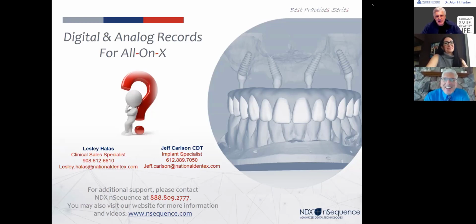As far as cone beam scanners go, I would very carefully look at the sharpness of the image, what they're showing you. There are a lot of machines out there now, and there's no really good resource to compare machines, as far as I know. So you really have to look at the image quality and the settings, because sometimes what they show you is at a different setting. Most machines you can range your settings. If you're doing a full arch case like this, you may have to increase your dosage. Again, the field of view: originally I had the original classic iCAT, and we could get a full image of the whole head. You don't really need that anymore. So if you're cutting that image, you're lowering the radiation. Depending on what we're looking for, that's where you have to change your settings. So take some time and look into the different options.